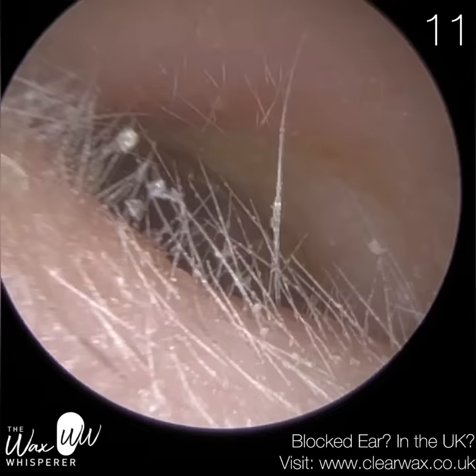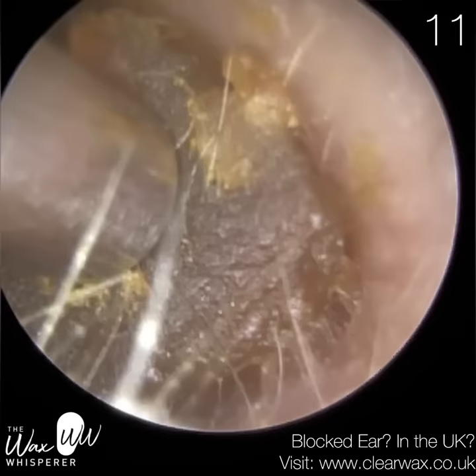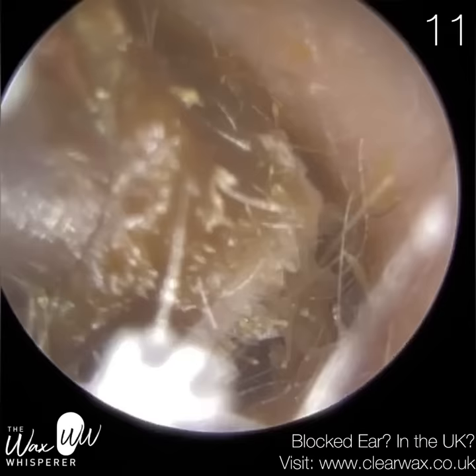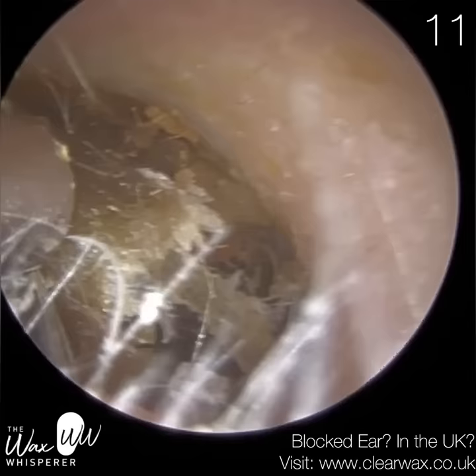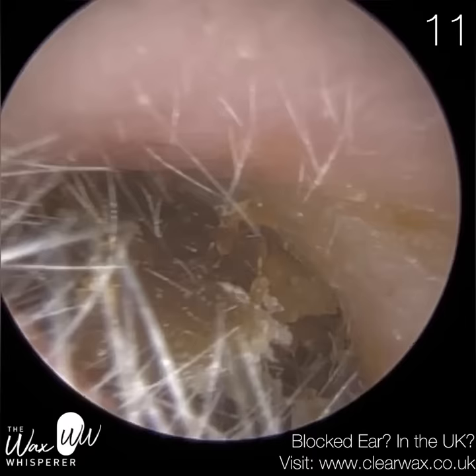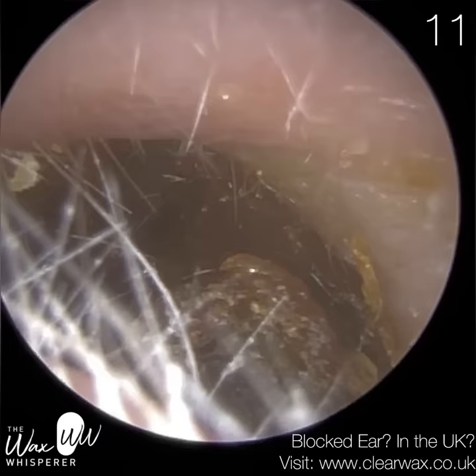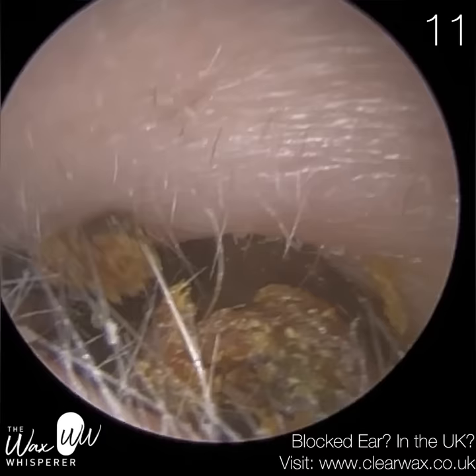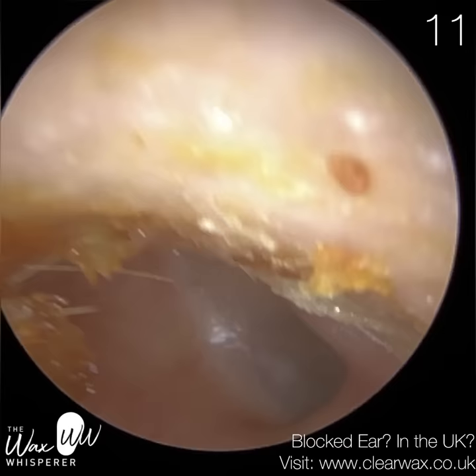Last but not least — this is ear number eleven. Again, a big plug of wax, quite dry. I'll go with the suction first — I can feel it's quite dry and embedded. I'm just trying to tease this away. The wax plug appears to be separating. I'm going to use the St. Bart's ear hook — I'm going to go to the roof and embed the tip of the hook into the core of this wax plug and slowly bring it forwards. As I do, I've got to be careful that the tip of the hook is not up against the canal wall, and I'm not applying too much pressure, because that can quite easily cut or abrase the canal wall, leading to trauma and possible infection.